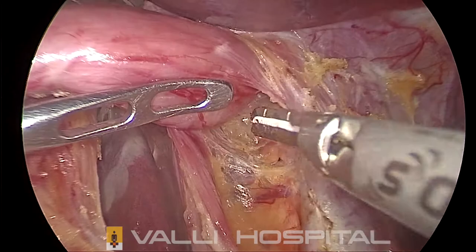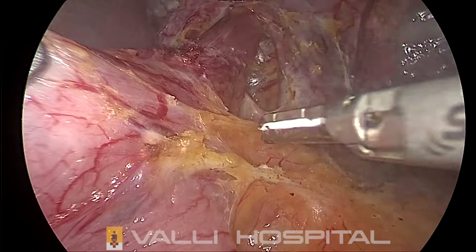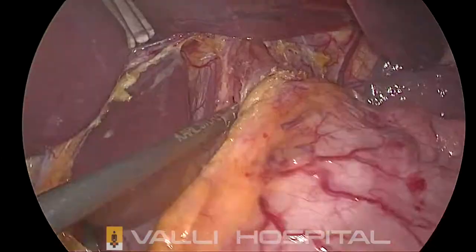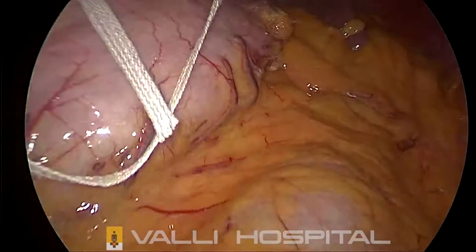Now, you can see both the crura clearly. There is still a little bit of fat. This will hinder formation of the retroesophageal window. So it is always better to divide it from this side. Now you can see the retroesophageal window nicely. You have to mobilize at least 6 cm of the esophagus.